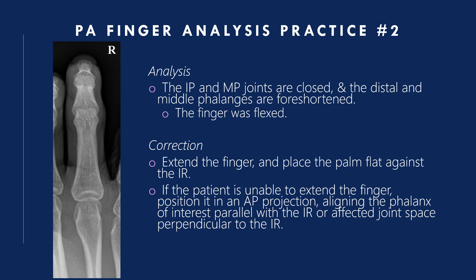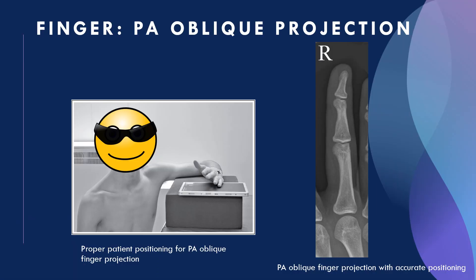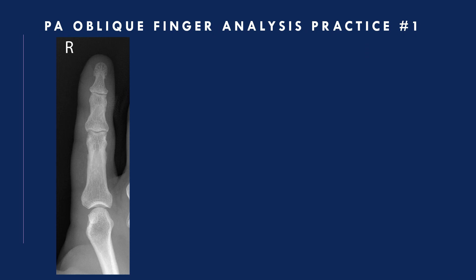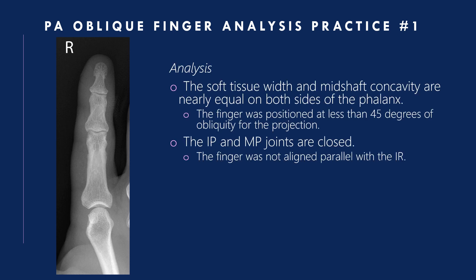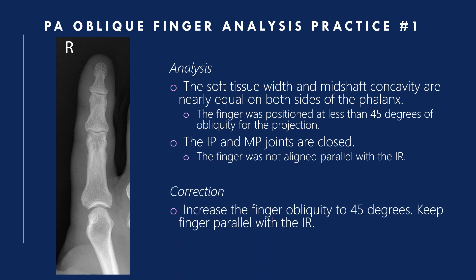PA oblique projection of the finger: here is an example of how to position for this oblique projection and an accurate positioning x-ray. Analysis practice one: the soft tissue width and mid-shaft concavity are nearly equal on both sides of the phalanx — the finger was positioned at less than 45 degrees of obliquity, and the IP and MP joints are closed because the finger was not aligned parallel with the IR. Correction: increase the finger obliquity to 45 degrees and keep the finger parallel with the IR.